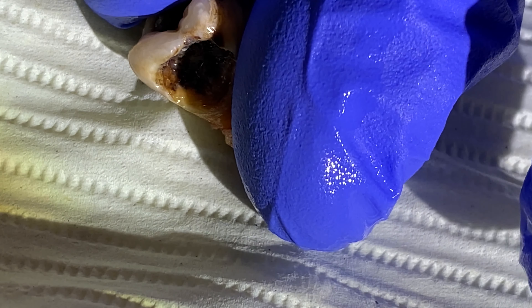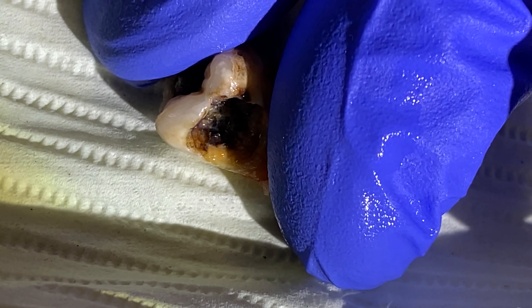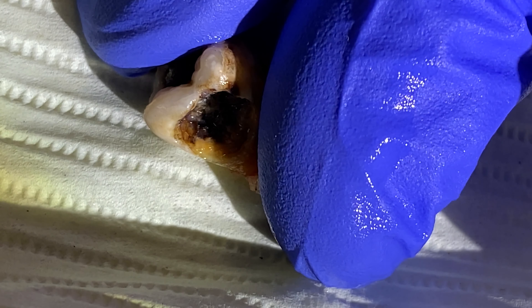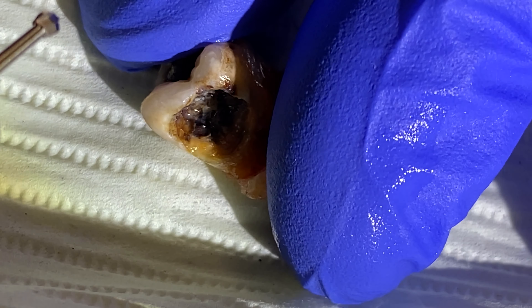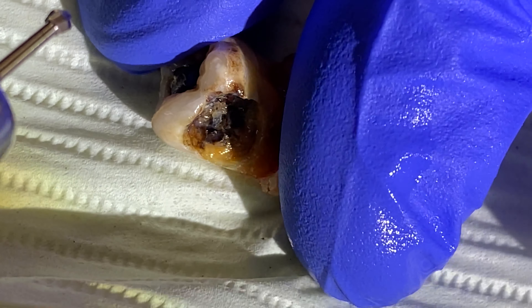This is a freshly extracted tooth, and you can see there's a big old cavity in it. This is what it looks like when we are drilling into a cavity.